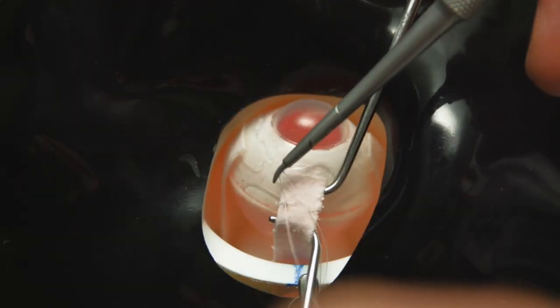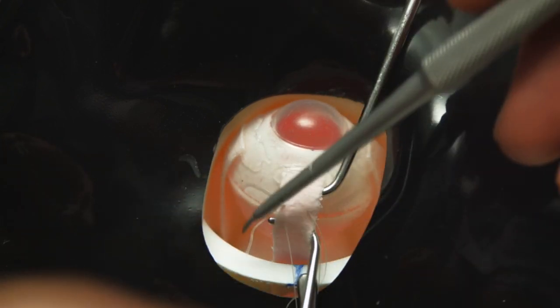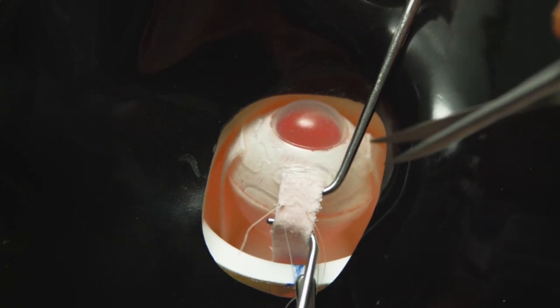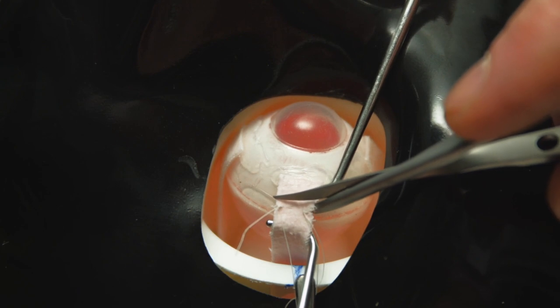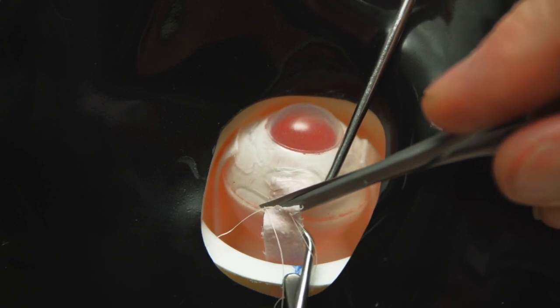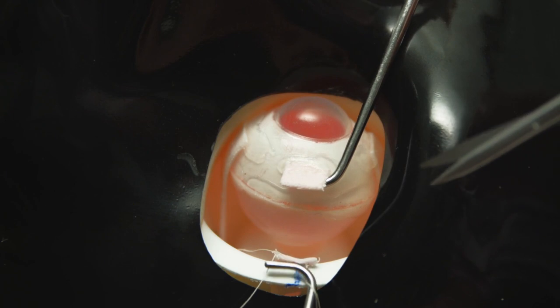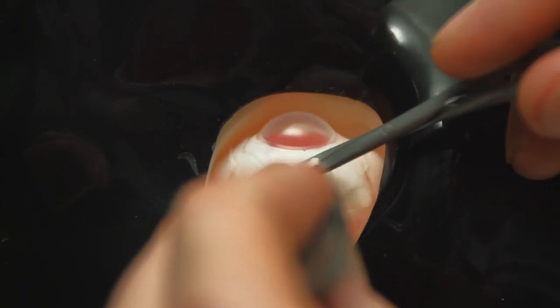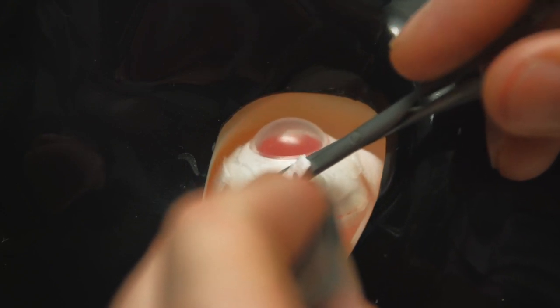When it comes to removing the muscle from the globe, if you pull on the lateral rectus at this point just as you're dissecting it, you can reproduce that realistic posterior movement of the lateral rectus when it is disinserted. As in real surgery, the rectus muscle stump is removed and we spend a little bit of time here just removing the extraneous glue from the original insertion site, which will enhance the realism of the reattachment process. You can see there's quite a large blob of glue being removed.